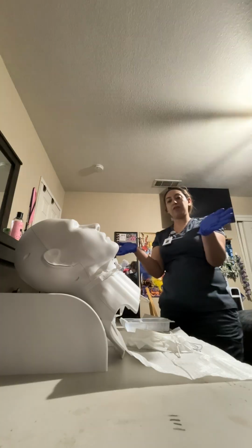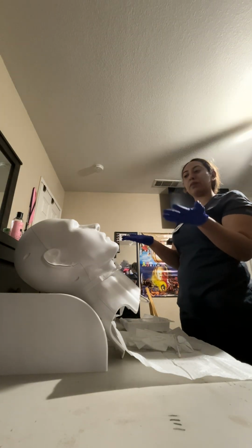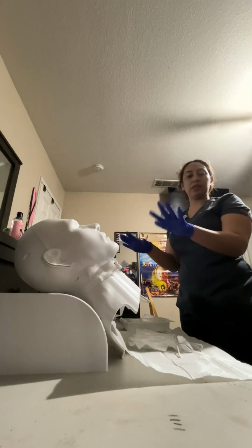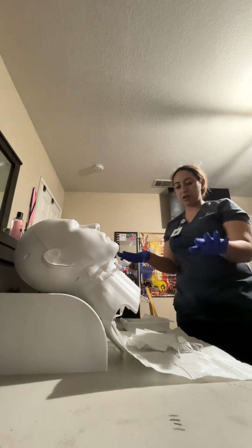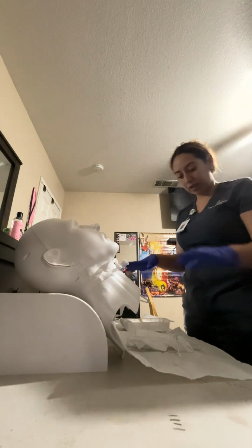Okay, now I have my sterile gloves on. I will make sure that I don't bring them below my waist, as they would no longer be sterile. So I have my sterile field set up. I'm going to just organize the items here so that it makes the cleaning easier.